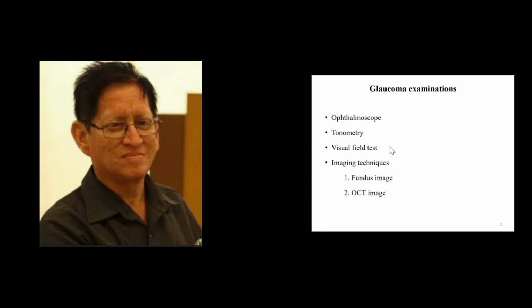Then we are moving to the visual field test. This test is useful to analyze the side vision of the eye. First, a moving light is passed across the patient's view. If the patient sees the light, they press the switch. Then the computer draws the map. Based upon the map, it will be decided at what angle the vision is lost.